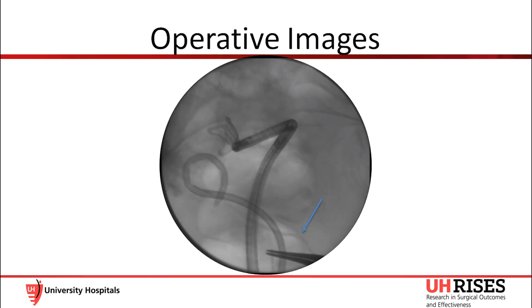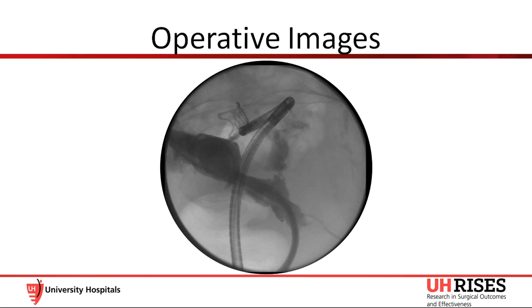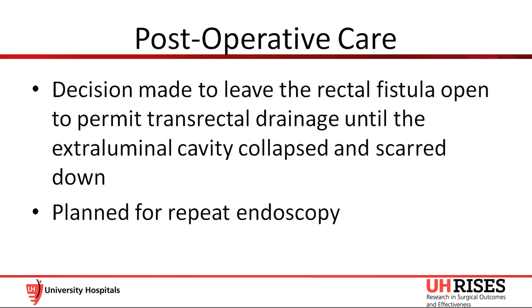We then turned our attention to the rectal stump. A spy endoscope was traversed through the fistula tract into the abscess cavity under fluoroscopic guidance, and the cavity was lavaged. A grasper was used to reposition our percutaneously placed drain superiorly in the pericolonic abscess. Both drains were visualized through the endoscope and were noted to be in good position. The previously noted prolene suture was endoscopically removed. While the scope was directly visualizing the cavity through the rectum, drains were injected and no contrast was seen in the cecum on fluoroscopy. Because the fecal side was closed and there would be no further fecal stream, we decided to leave this open to allow it to drain, with a plan for future evaluation and potential endoscopic clip placement.